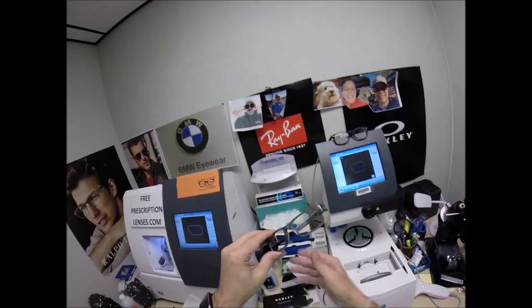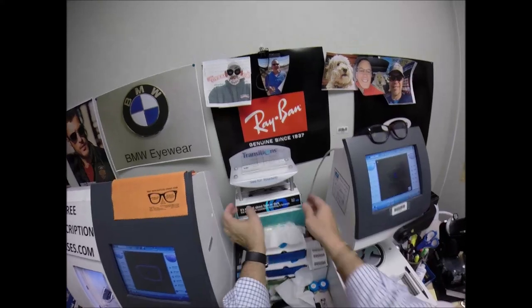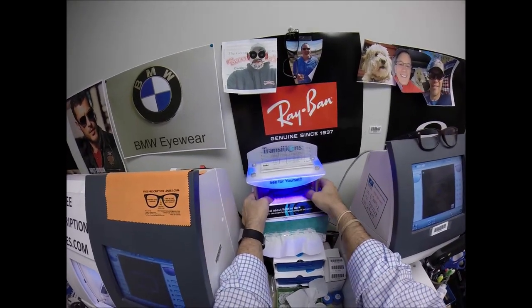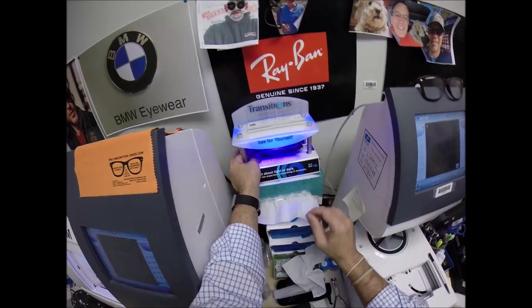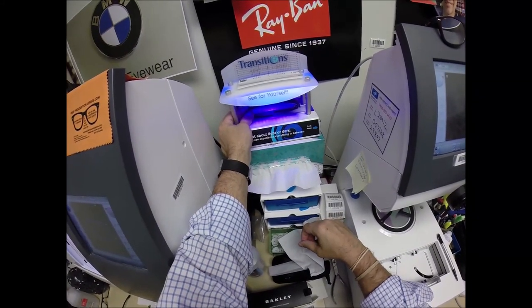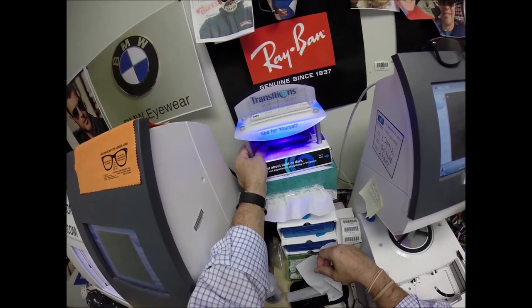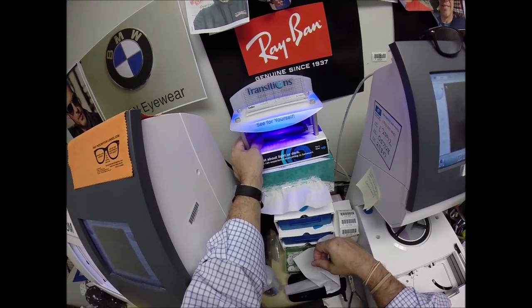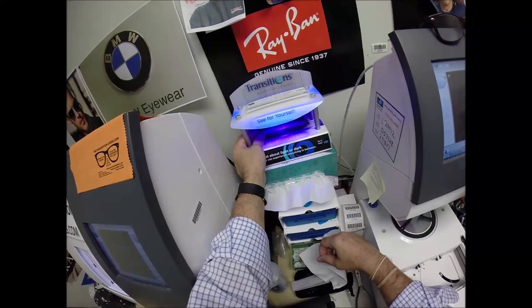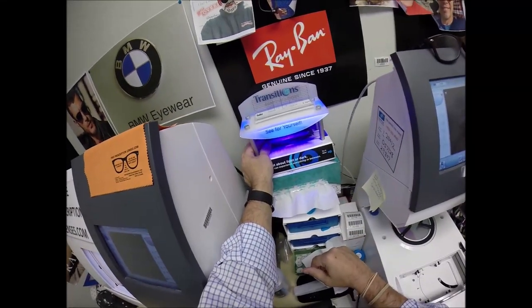Let me go ahead and put these in a strong burst of ultraviolet light to turn them dark. As you can see, it takes about 30 to 45 seconds for transition lenses to darken. A little bit longer when you come back inside, 45 seconds to a minute 15. Now, Leif and everyone else listening, pay attention. All transition lenses will get dark on day one and continue to darken every day for the first couple weeks they're exposed. After that, they will work for years at maximum performance.